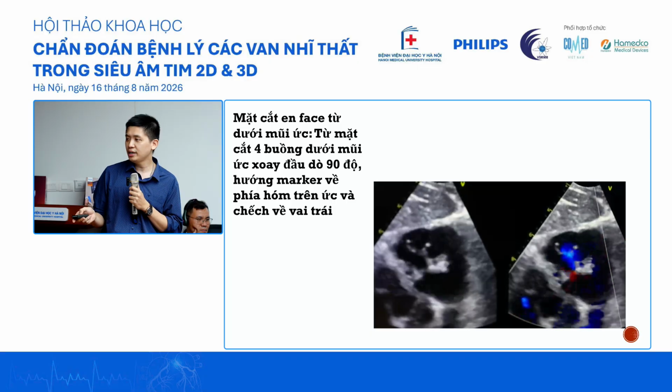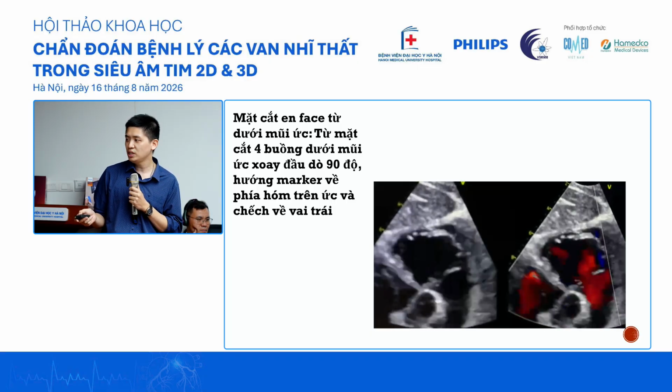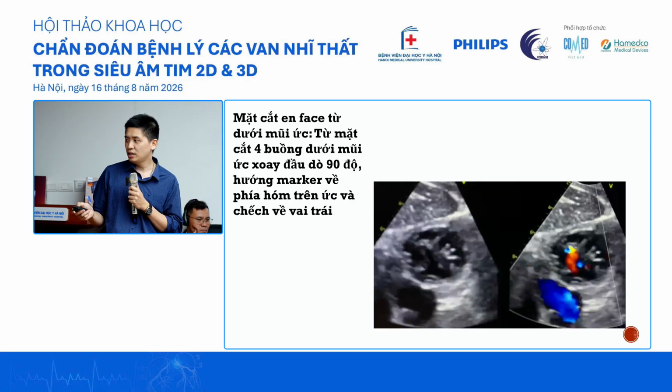So you can try to cut the en face view of the valve from the TTE. I see it visible in maybe half of the patients, I think. It could help you identify the leaflets better.